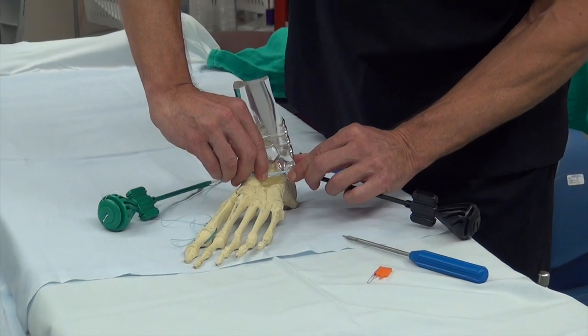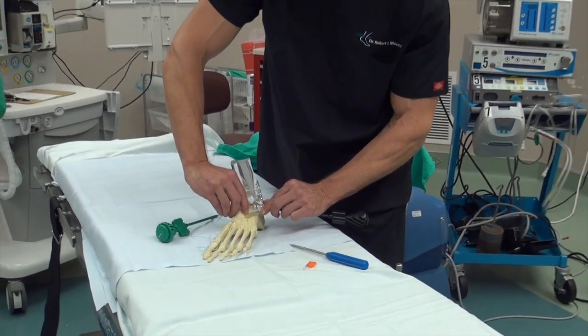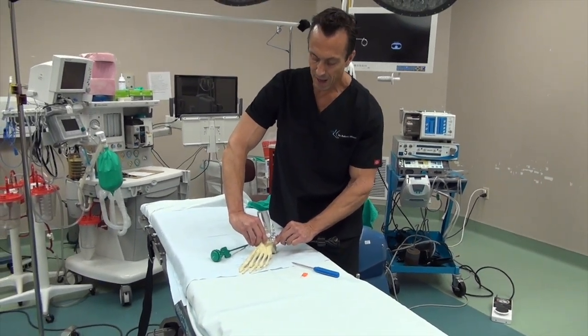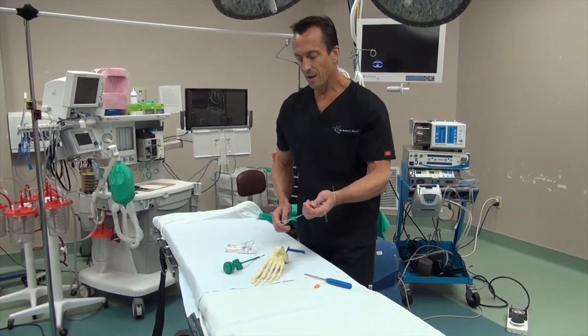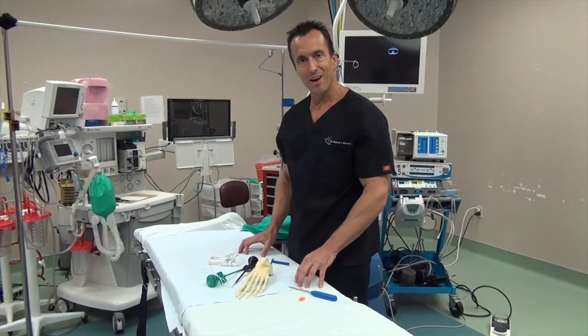So not only do we have the ligaments holding the ankle together, but the internal brace reinforces it so the ankle will never sprain again. That's the internal brace system by Arthrex. Now we'll perform a procedure and show you how it's actually put in with a live patient.